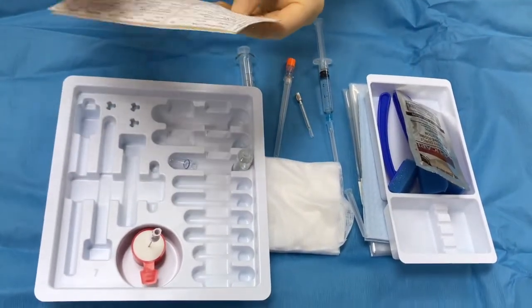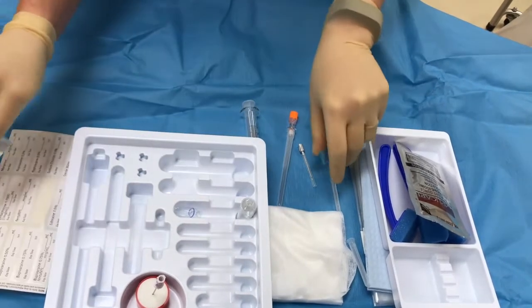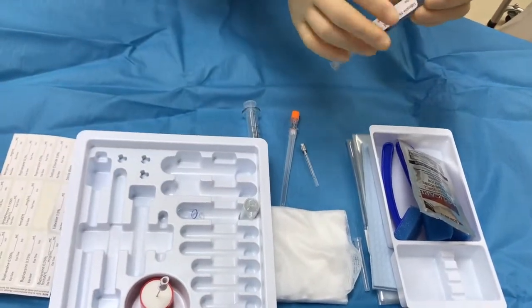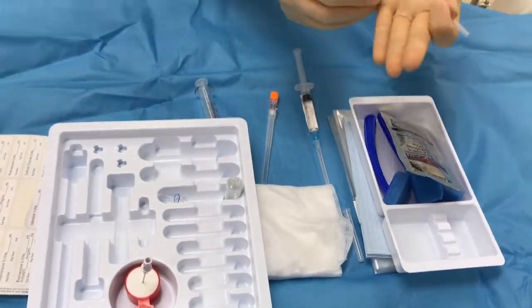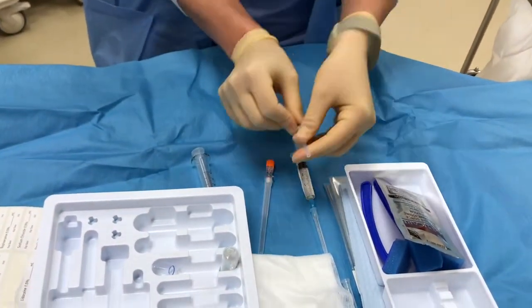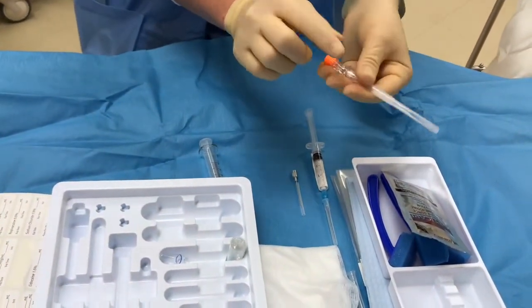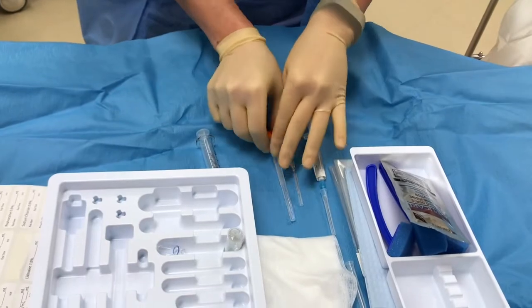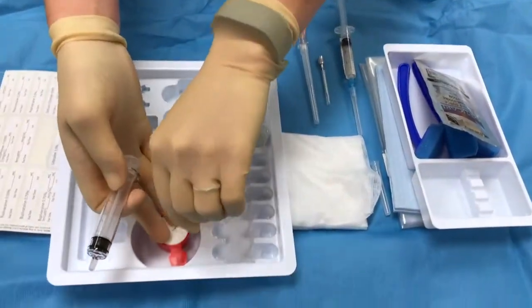And then you can go ahead, obviously, and label these if you'd like to, especially in the beginning, if you're afraid of mixing up your medications. And then we have our introducer needle. That's going to come next. And then our spinal needle, with the bevel facing up and the cleft facing up. And then we'll drop our spinal dose in the glass syringe.